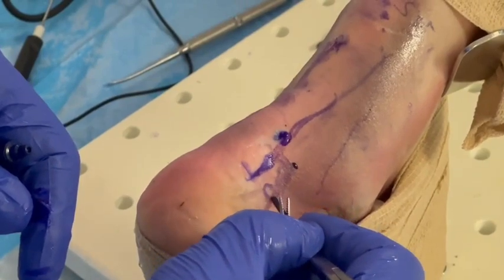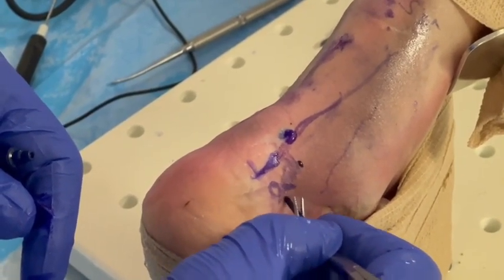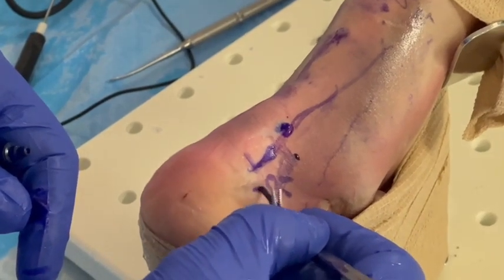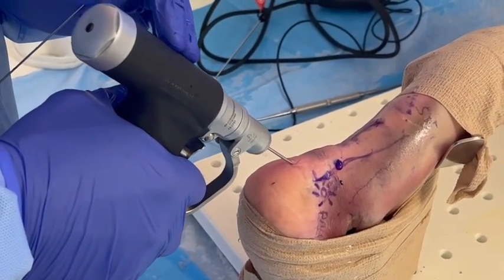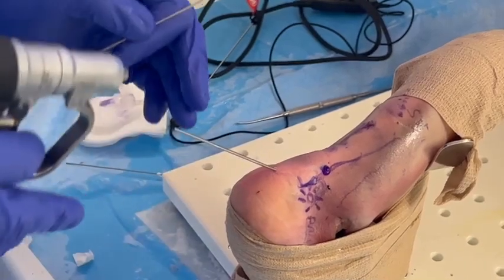If a Haglund's deformity is present, the site of maximal pain is marked out and an additional distal medial portal is established. A K-wire is inserted under fluoroscopic guidance to provide the surgeon with direct endoscopic visualization of the osseous resection level.